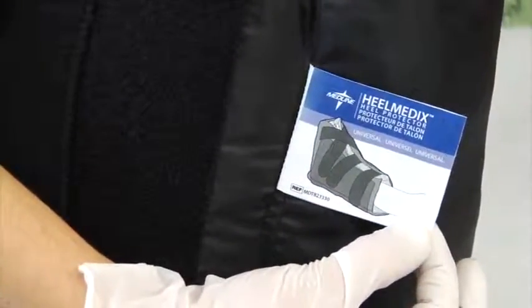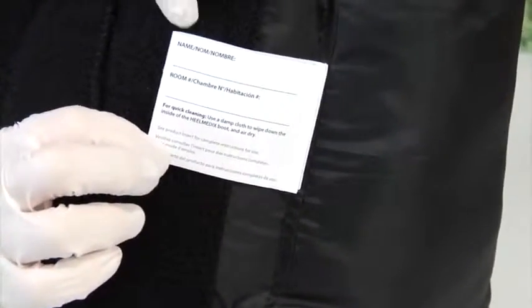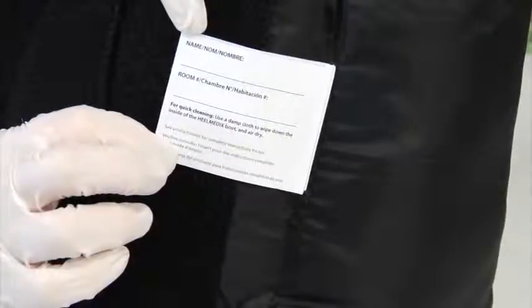Check to see that the heelmedix tag is on the outside of the boot and near the bottom of the patient's foot. If it is, you've applied the boot correctly. You can also label the patient's name or room number to help simplify washing and sorting.